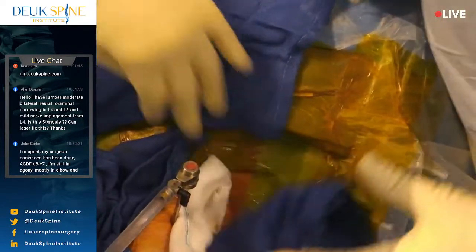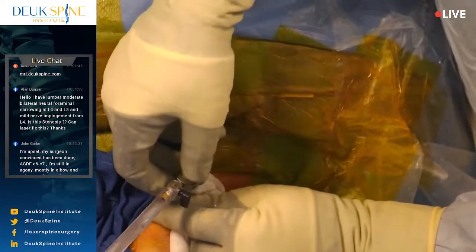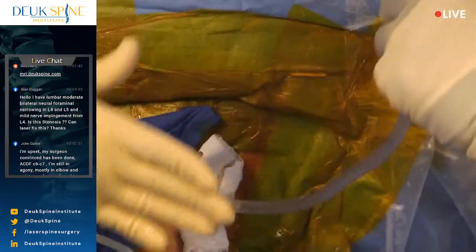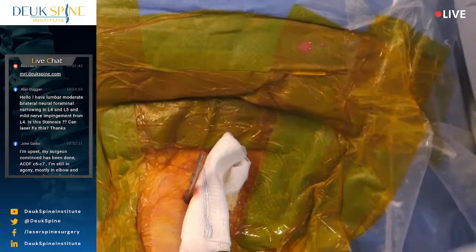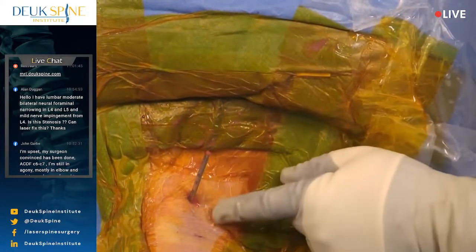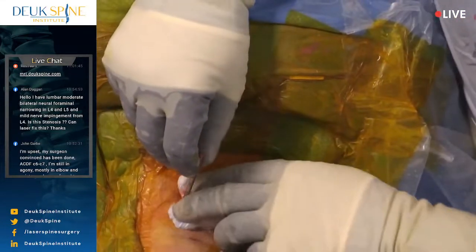All right, let's show everybody. Can you guys see this okay? I'm gonna take this vacuum little adapter off. Can you guys see the tube? Show them the neck. Yeah, that's good, guys. Here, let's move this too. You guys see we did the whole surgery in that little tube there. So we got two holes, like a little vampire.